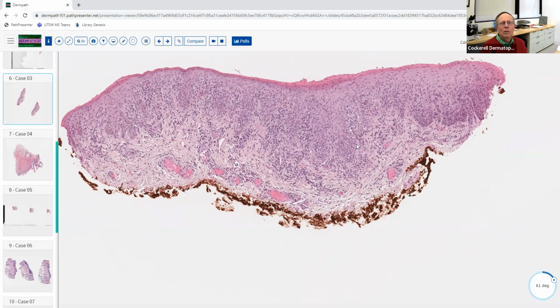And usually you don't get parakeratosis. It's usually thick hyperkeratosis. If there's any parakeratosis, it's kind of wedge-shaped hypergranulosis, and it's a little bit right above that. But that thing can simulate a cancer. That's the problem there, that you get the pseudoepitheliomatous hyperplasia and it gets misdiagnosed as a squamous cell, and then they start doing Mohs on somebody's anterior shin, that sort of thing.